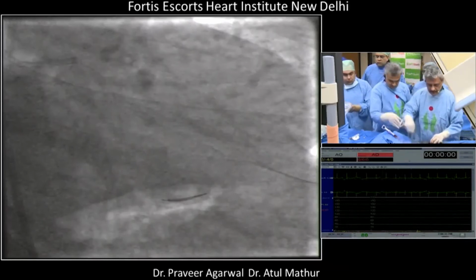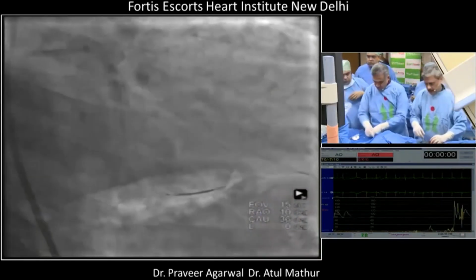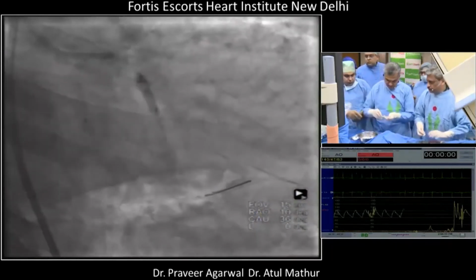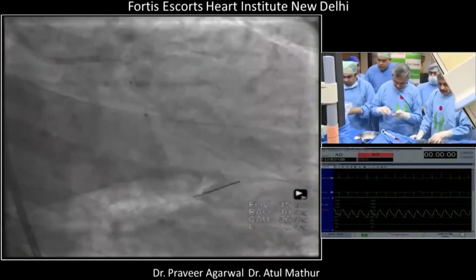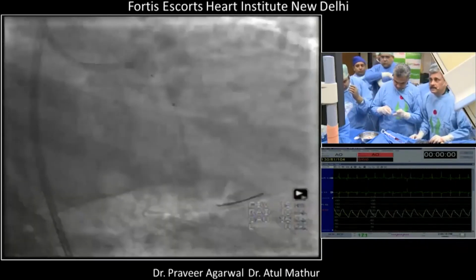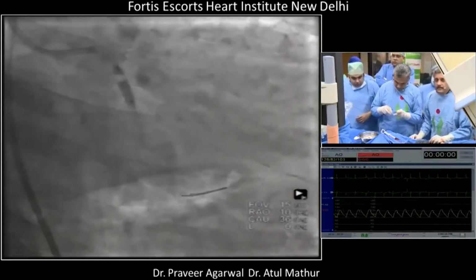Keep it there. So now let's see if we can rewire it. Okay, just show us rewiring, and then we'll leave you to complete the rest of the work. All right, excellent result, though. So just give us a moment to see whether this balloon goes well, and otherwise you can tell us whenever you're going off.